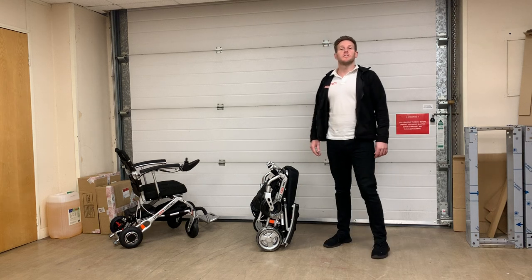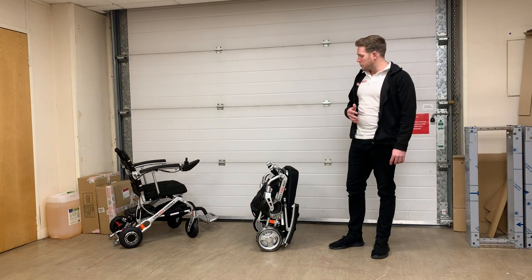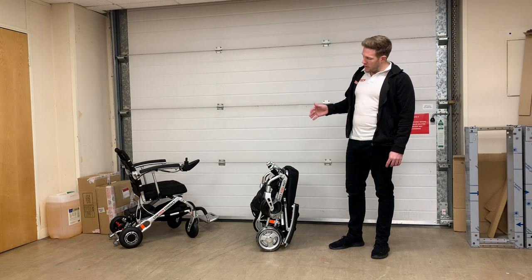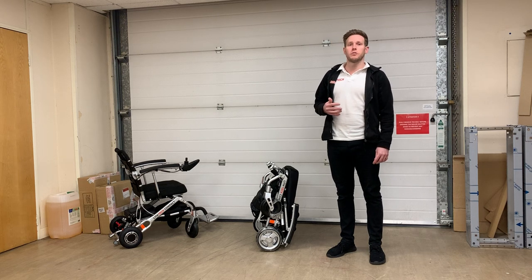Hi, this is Toby from Liftec Mobility. In today's video we're going to be talking about our most lightweight compact folding wheelchair. This is our Liftec Compact — it's actually the world's smallest folding and most compact wheelchair.